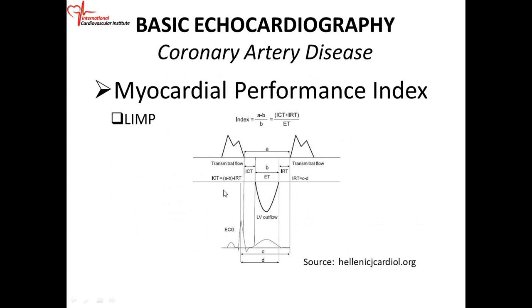So when you're doing LIMP, when you're doing RIMP, it's a little bit different because you have to do two sets of measurements, unless you're doing tissue Doppler imaging. If you're doing pulse wave Doppler, then when you're doing LIMP, this is what you want to see.